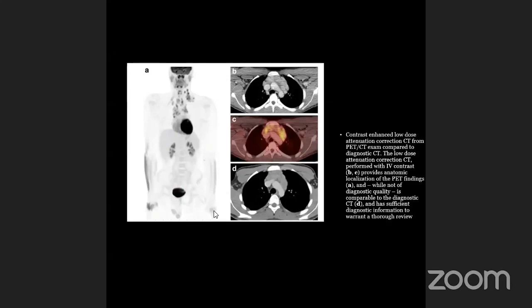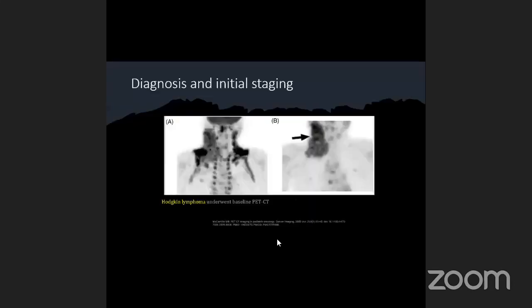So muscle activity. Agree. Why muscle activity in this patient? What he did before he started the study, the exam? You know, this is FDG, like glucose metabolism. So if somebody did some muscular activity, yes, perfect. So you have to be careful about some pitfalls. Let's go on another pitfall.